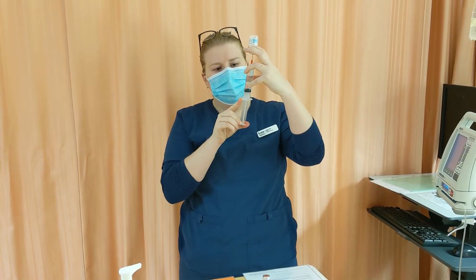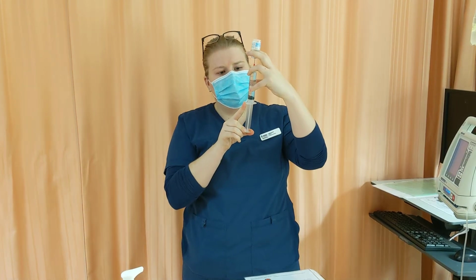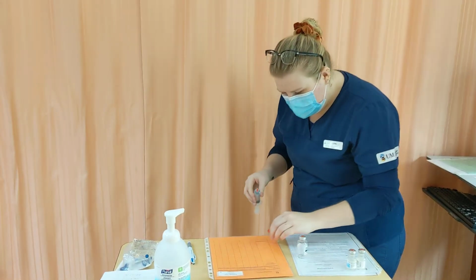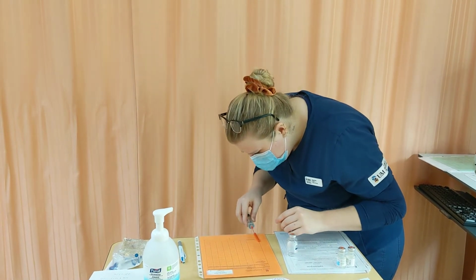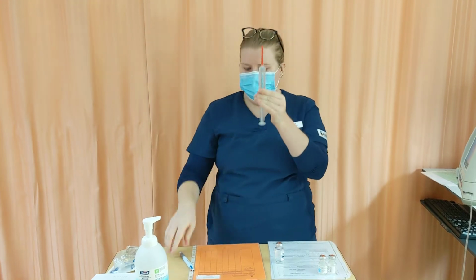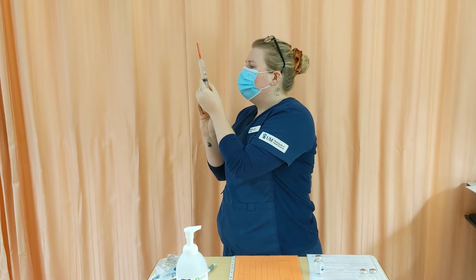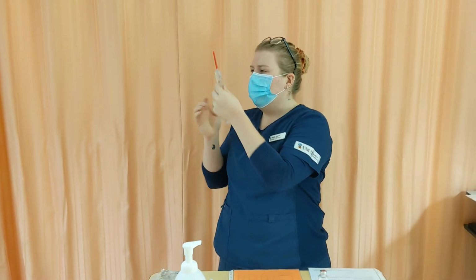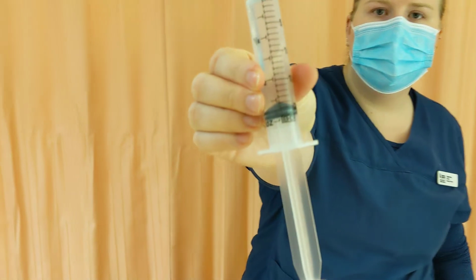Making sure that I'm not breaking sterility here. I'm going to draw back a little extra so that I can knock out any bubbles. Once I've done that, I'm going to recap. So that's good. Knock out any bubbles. Pull back a little bit. Okay, and then I would do this over med waste. I'm just going to push up to my 20 with no bubbles. So we have 20 mLs with no bubbles, just so you can see there.